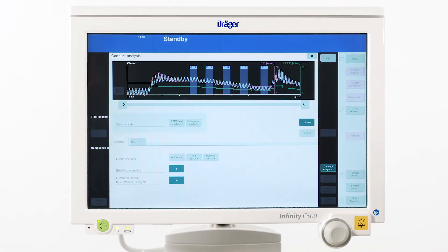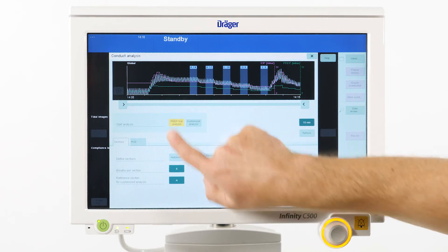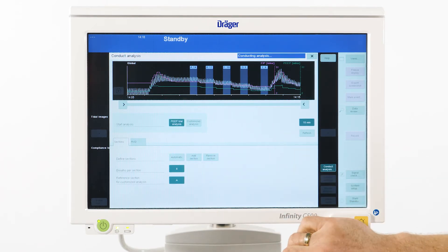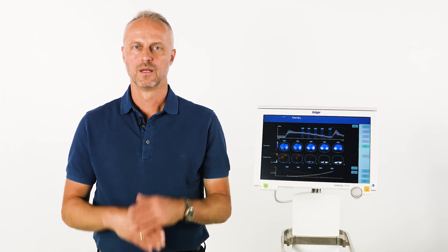Once we have verified that the algorithm has assigned all sections correctly, we simply press the button PEEP trial analysis. Now, coming to the most interesting part: how are the results of the analysis represented?